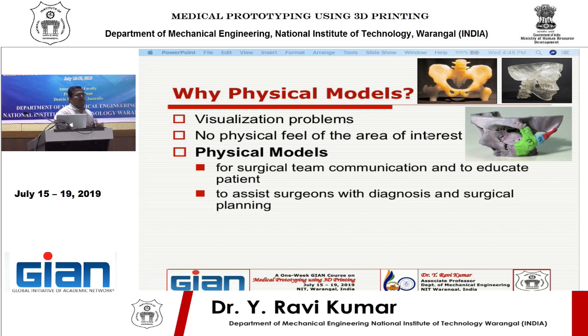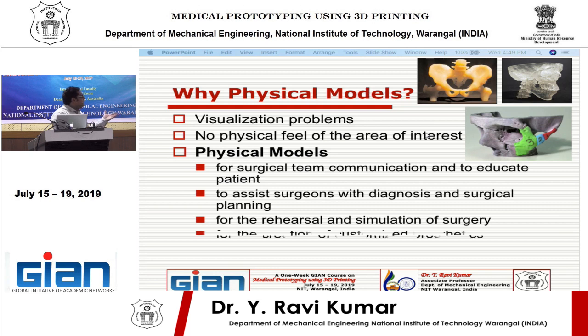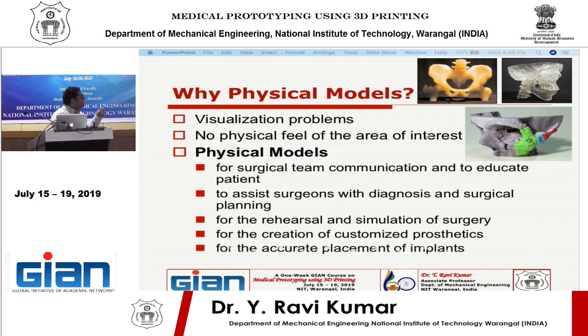So wonderful, you can plan, or you can even do planning of the surgery, rehearsal of the surgery or simulation of the surgery. Finally, the best surgery ever before or an innovative surgical procedure, you may end up with such opportunities once you have a physical model with you. And even it can be customized prosthetics, or it can be accurate placement of your implants. Once you have a physical model, you can accurately place it, not a guessing game or assumptions, no guess. It's a 100% fit.